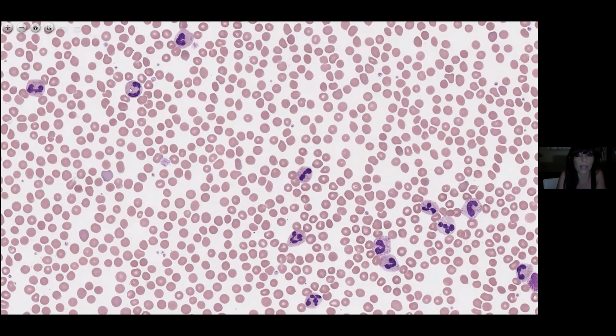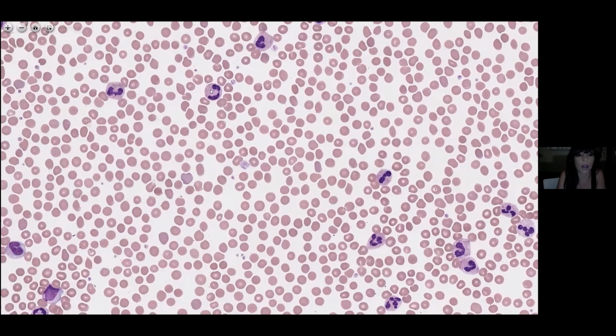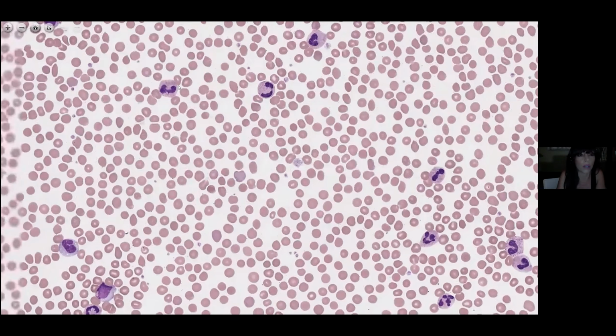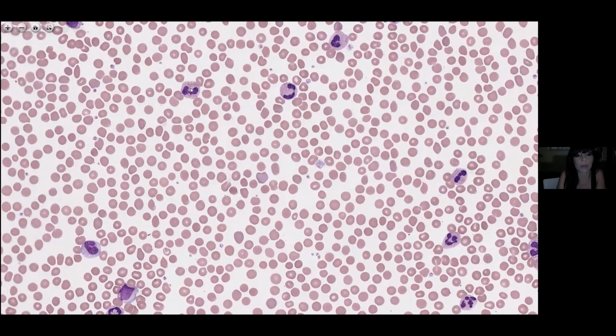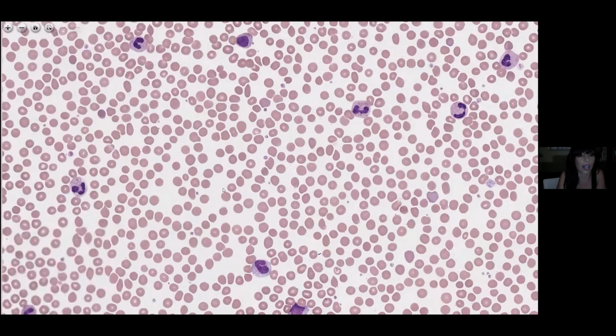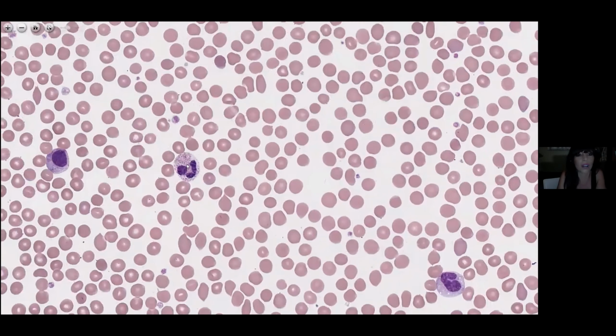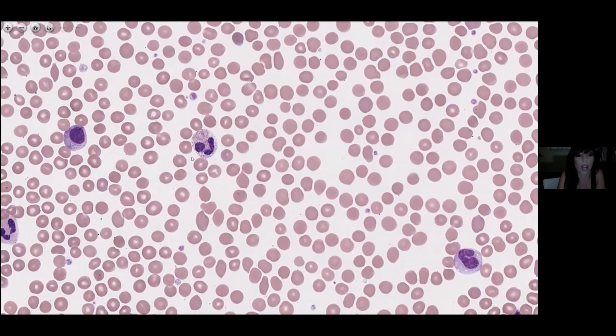I know in our API surveys, we stopped differentiating them for our lab surveys, our unknown specimens that are sent. They have us lump them together because they also saw that discrepancy. So they stopped separating those two out. I think it would be really nice if we didn't call it, but I think our physicians want those to be called.